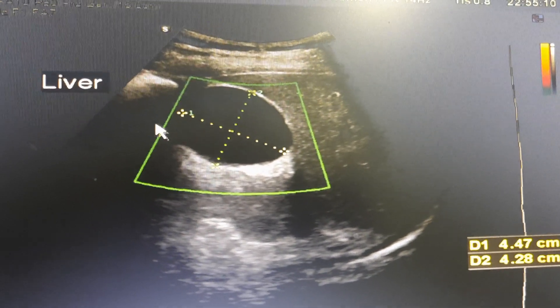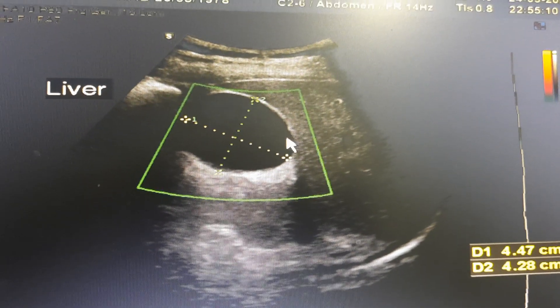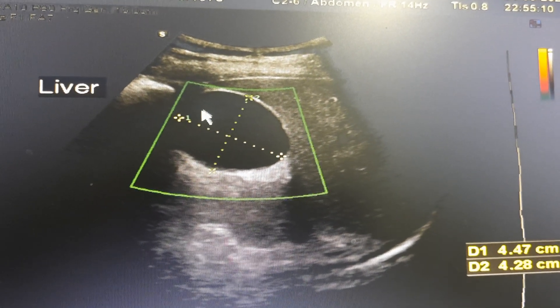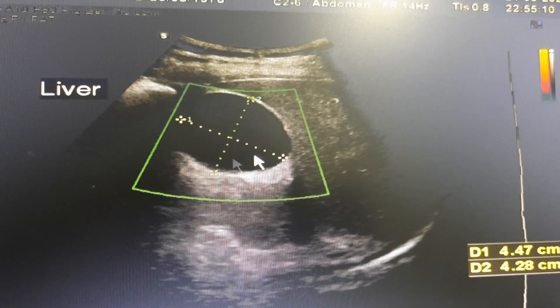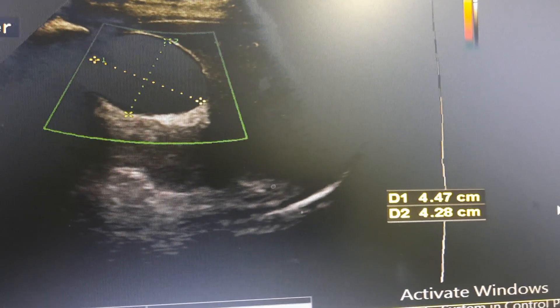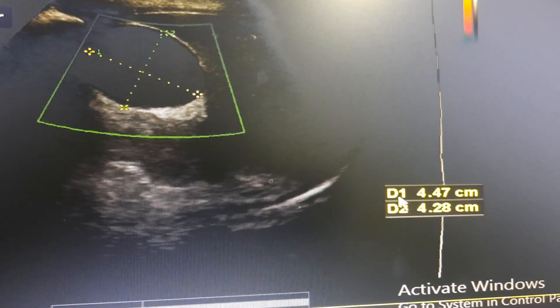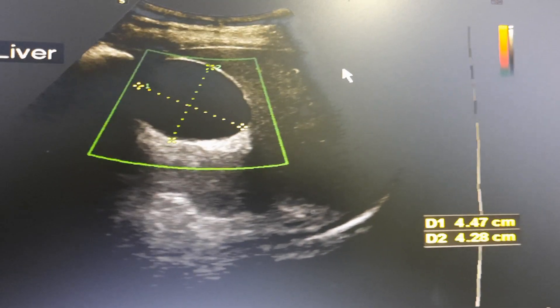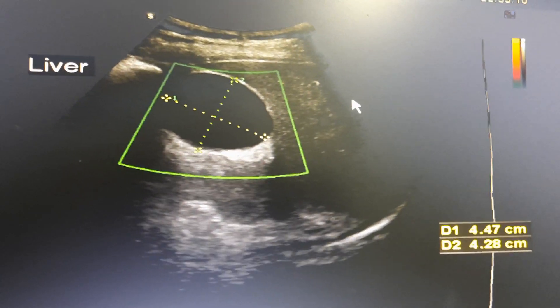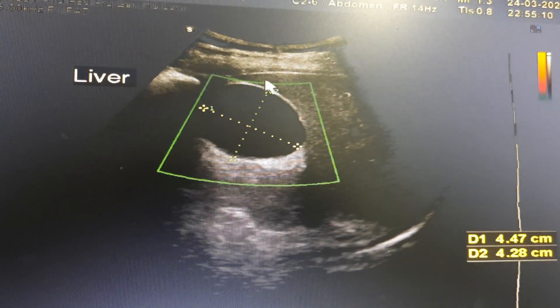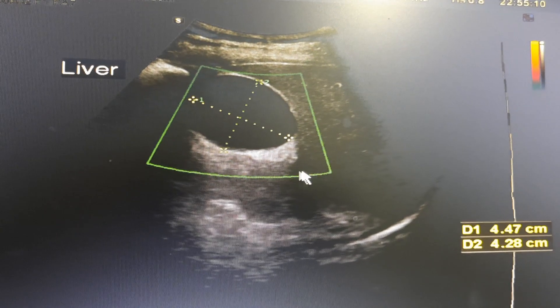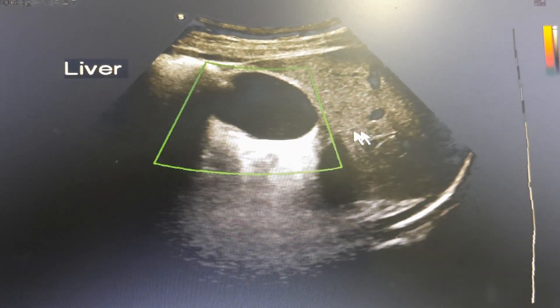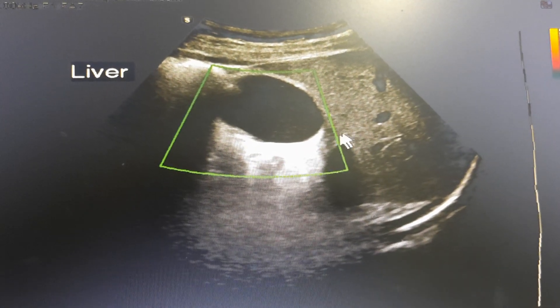Something like this, measured like this — this is in the liver, in the right lobe of the liver. And this is the one.